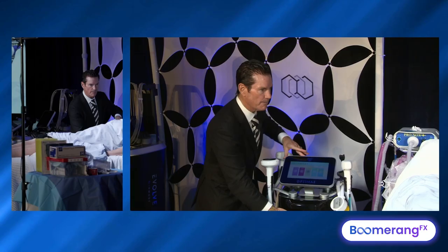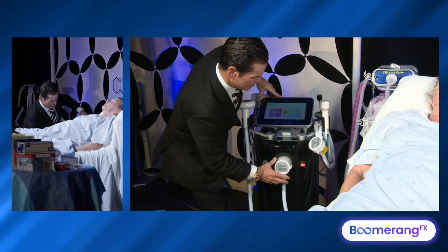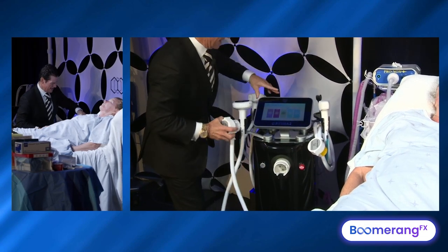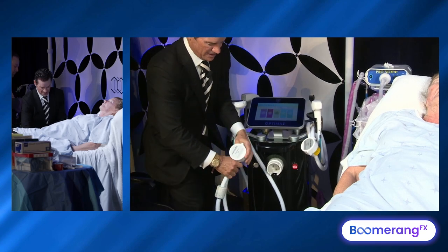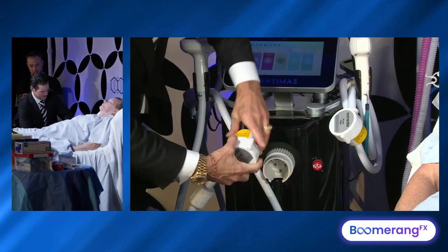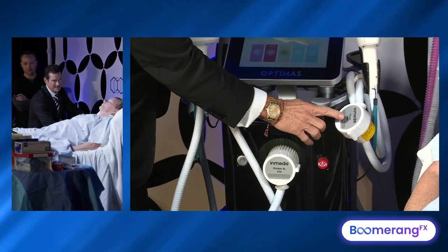And we are back on the optical side of things. And so you see that we switched out our 515. We're going to switch that out, leave it hanging here, and connect our 810 diode laser to the front of the system very easily. Easy to swap out your opticals on the front. We also have the vasculase, the 1064.